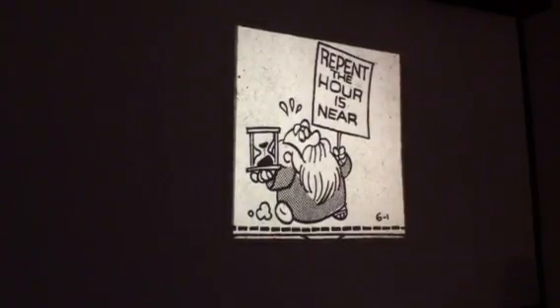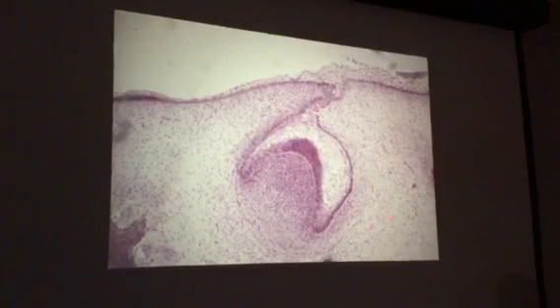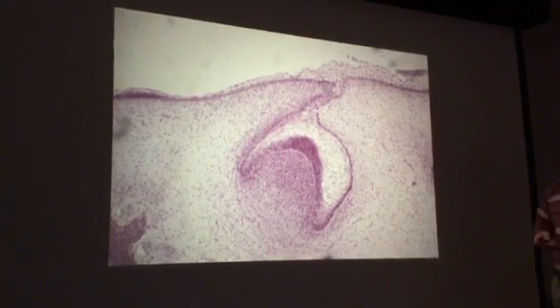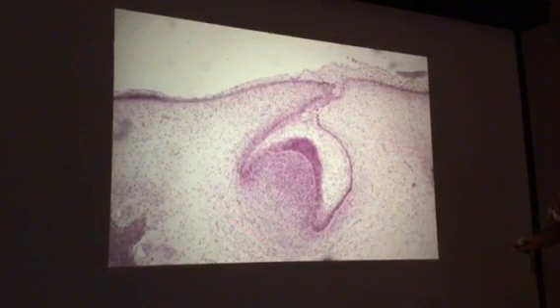Test is tomorrow at 2, so let's go on here. Okay. What stage? Yeah, I meant quiz. Okay. What stage do we see right here?